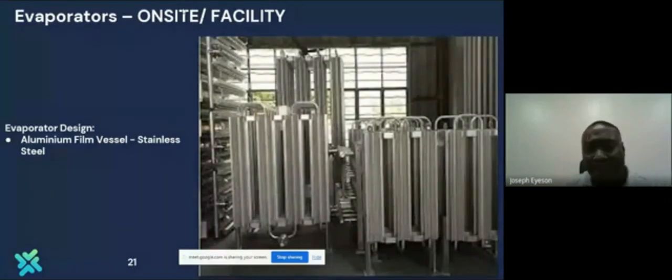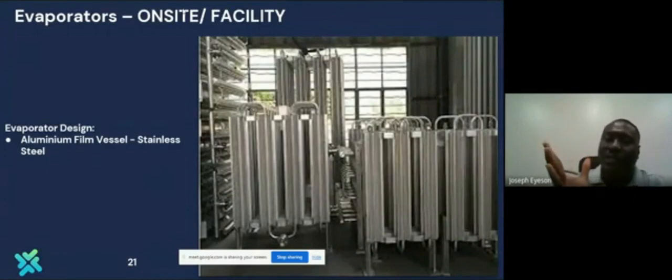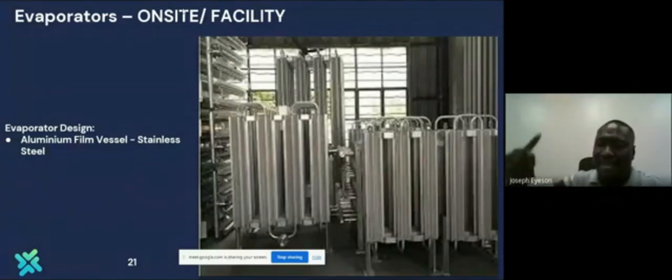One end of the evaporator is connected to the VIE tank, and the other end is connected to the pipeline with some regulations, regulators and a control system. The liquid oxygen comes to one point and flows through, there is heat exchange within, and the liquid converts to gas.